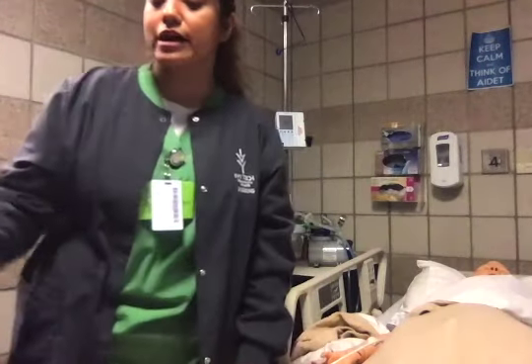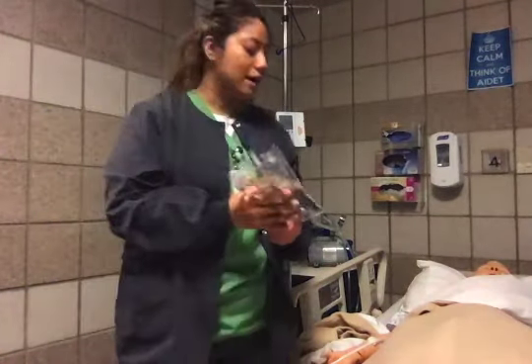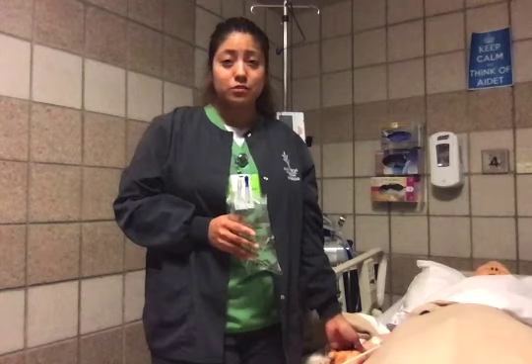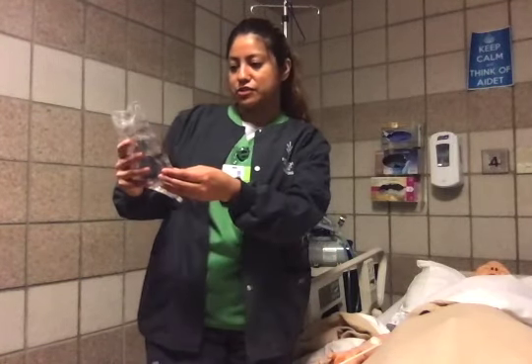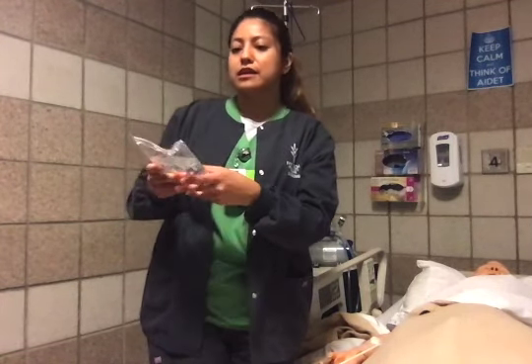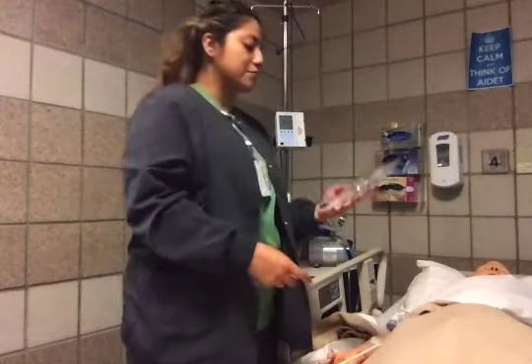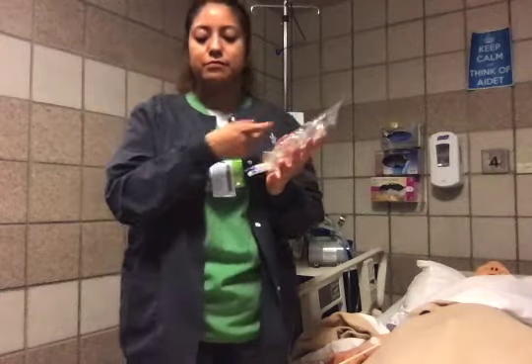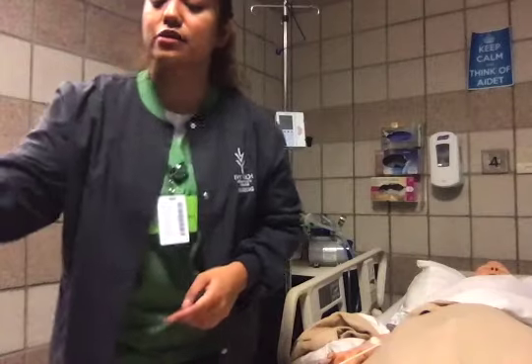Okay, so I'm at the bedside and I will perform my third check. I am going to grab my medication. I have the right patient. I already confirmed his name and date of birth. I'm going to grab my bag of saline and make sure that I have the correct one that the doctor ordered, and I will scan my patient's wristband. Beep. And I'm going to scan the bag as well. Beep. Okay, I'm going to perform hand hygiene, and I'm going to grab my gloves.